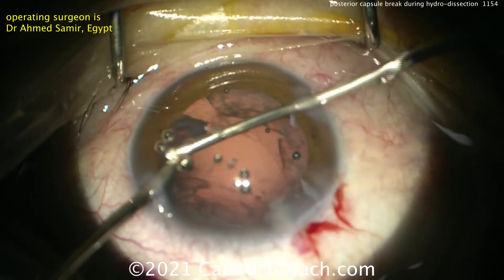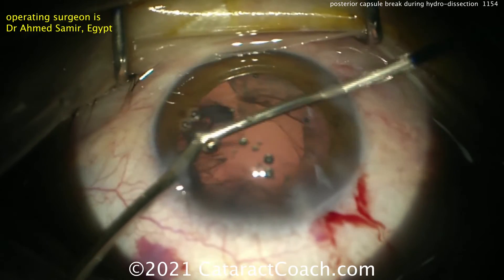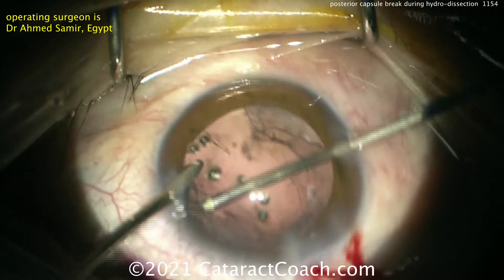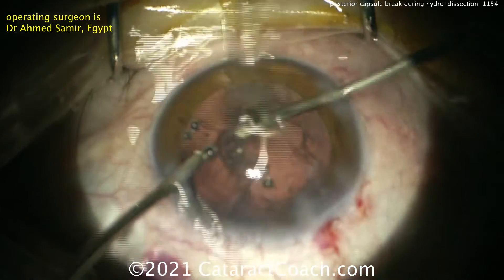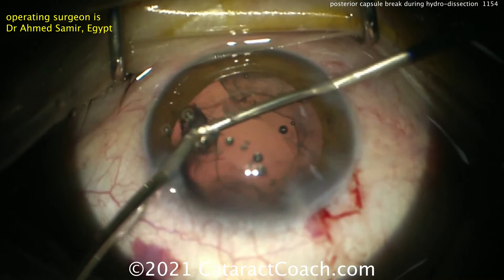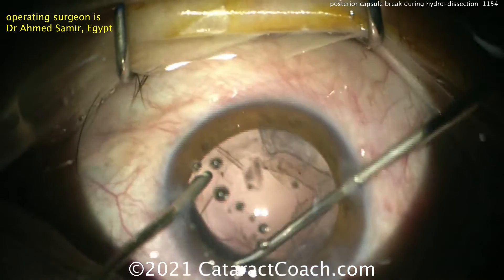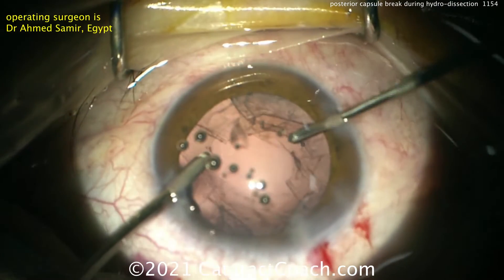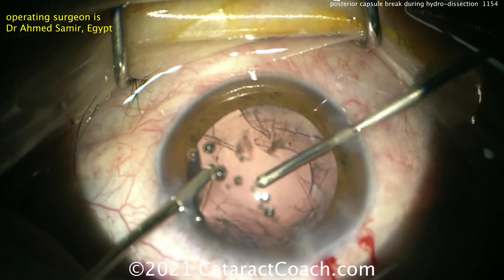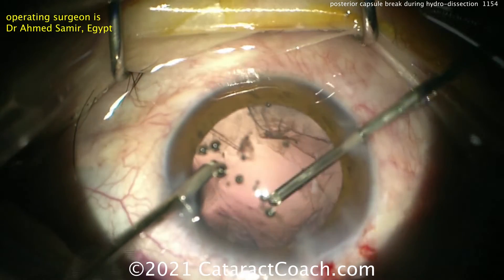It's very important to know how to clean this up. Remember you have two settings: to remove cortex, the setting is irrigation-aspiration, then cutting — IA cut. To remove prolapsed vitreous, it's irrigation-cut-then-aspiration. If you're worried about removing cortex and don't want to inadvertently engage the cutter, you can use the bimanual vitrector setup with the cortex removal setting on your phaco machine so the cutter will never engage. You have foot control to be able to do it in the vitrectomy setting.